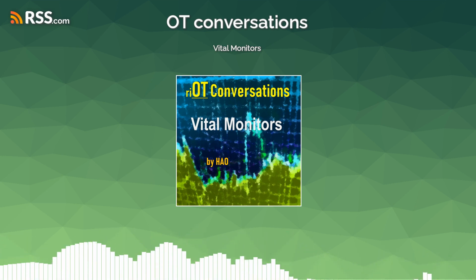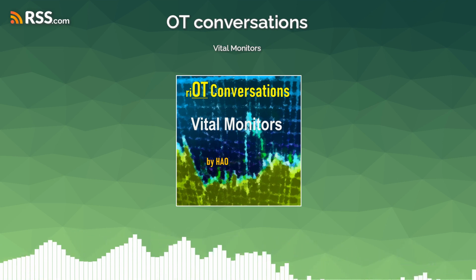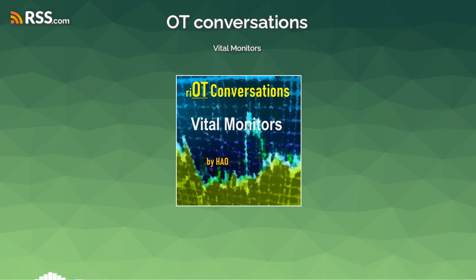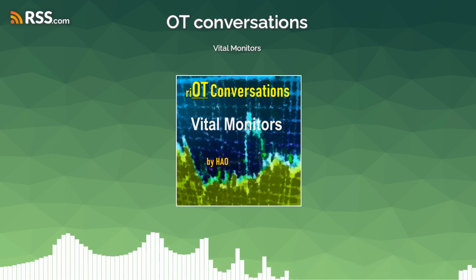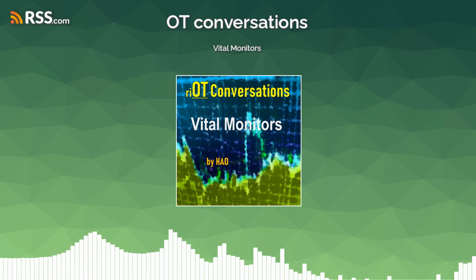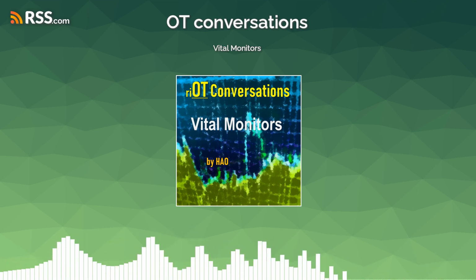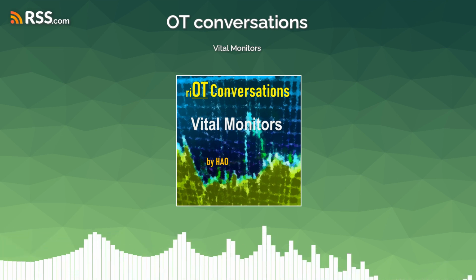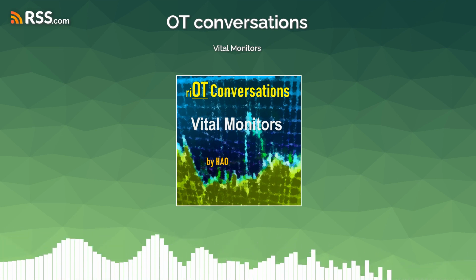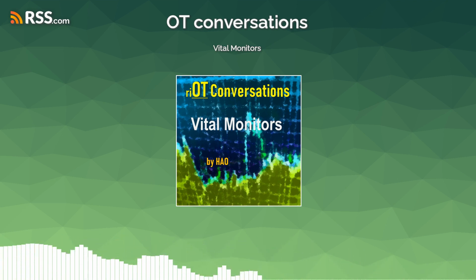In this episode, I'd like to talk to you about the different types of monitors that you will be seeing with a patient. So, when it comes to monitors, there are different types of monitors that you will note when you are working in critical care. These can be electric monitors, monitors that measure electrical impulses, or monitors of some of the fluids in the body, and particular, specific pressures.